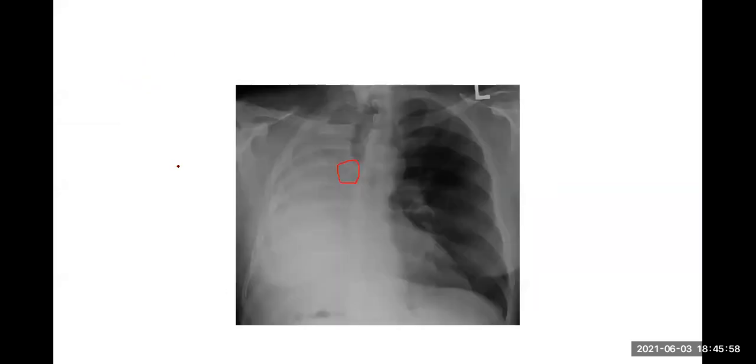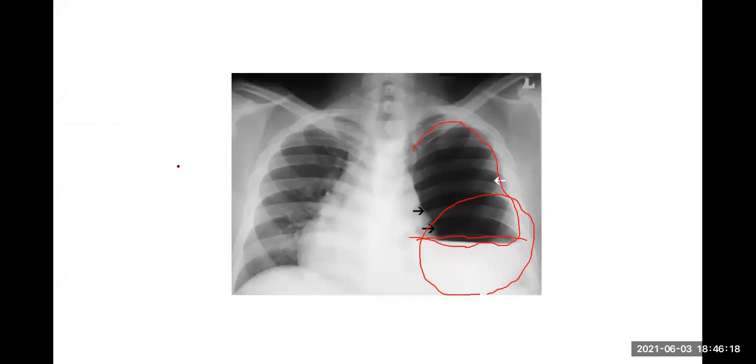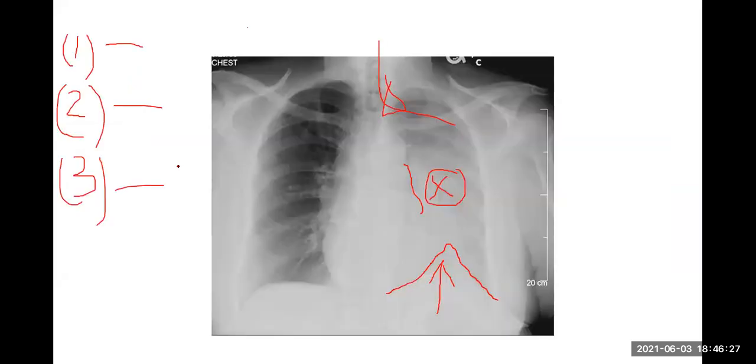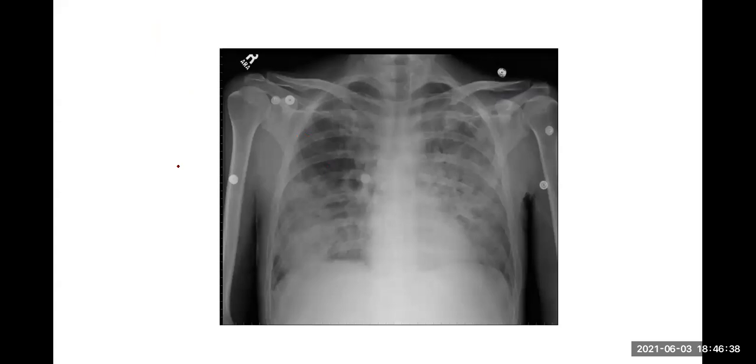Hari. දැන් අපි ඒ ටිකයි පොඩ්ඩක් බලාගෙන ඉමු. So chest X-ray, airway, lung shadows, bones and blood vessels, heart shadow and diaphragm. Those are the things that you look at. White lesions, black lesions. White lesions can be upper border, sort of this sort of pleural effusion, hydropneumothorax, a heterogeneous opacity, air bronchograms, consolidation, white out on one side, right? Three differential diagnoses, collapse and pneumonectomy look the same sometimes, right? And then various types of consolidations also have shown.